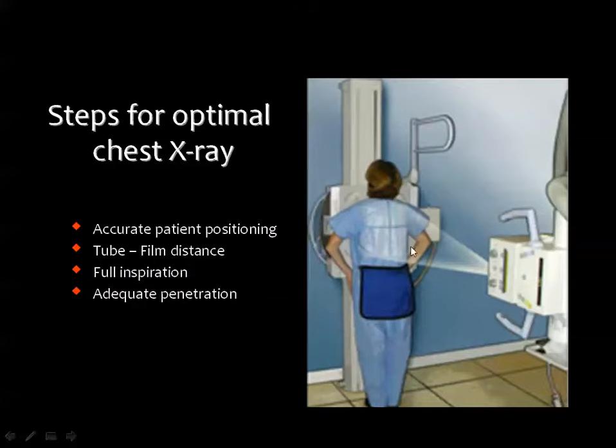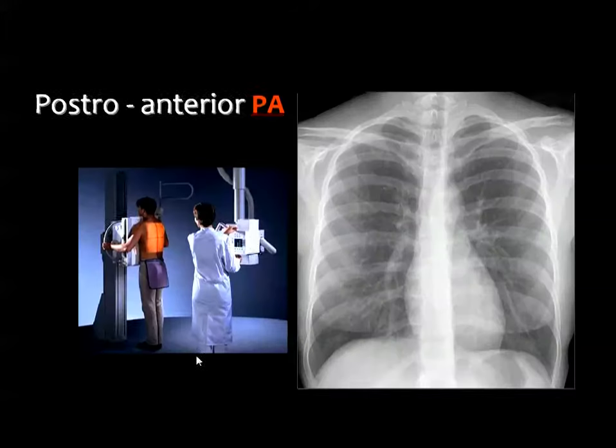These criteria include accurate patient positioning while being radiographed, and instructing the patient to have full inspiration before exposing the x-ray film. And we select the radiographic factors which are suitable to the size of the human body. Then how can you know these parameters in detail while you are not attending the technique of chest radiography?